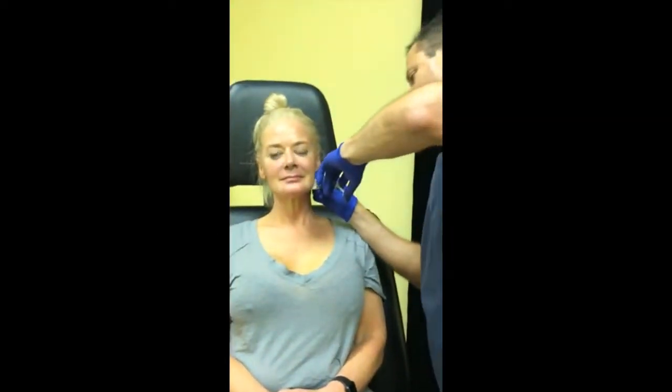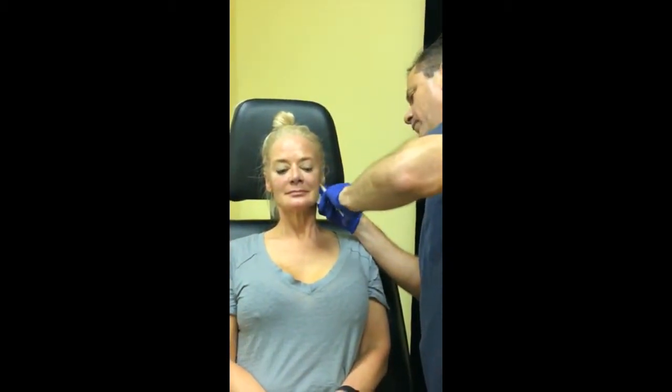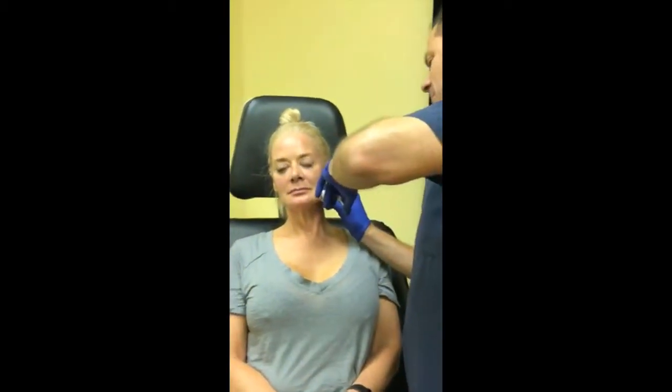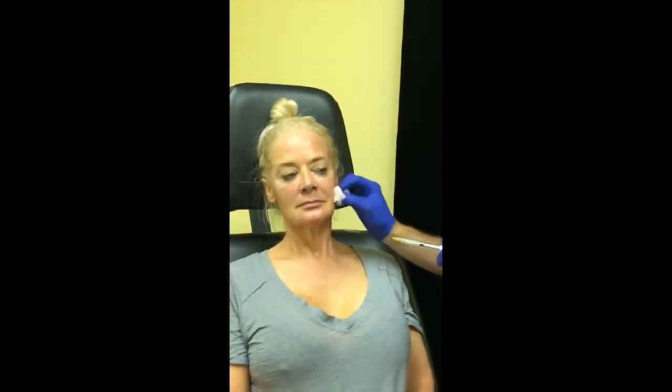I just want to make sure we're symmetric. Results are pretty immediate. It's interesting because it seems in most people that your new collagen forms at roughly the rate that the artificial collagen in the product is going away, so you just maintain the same level of correction.